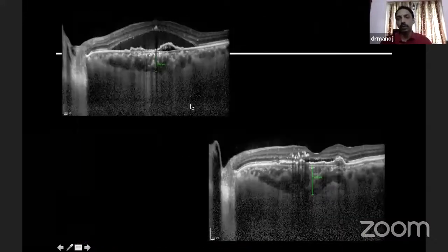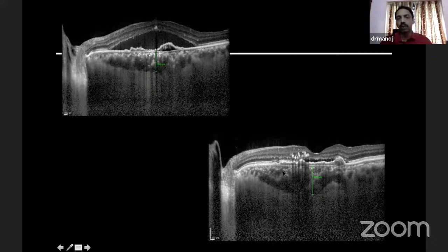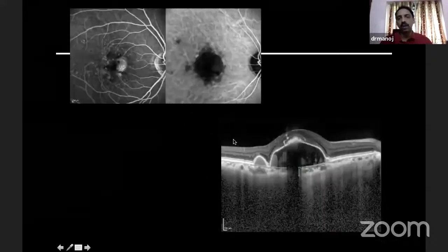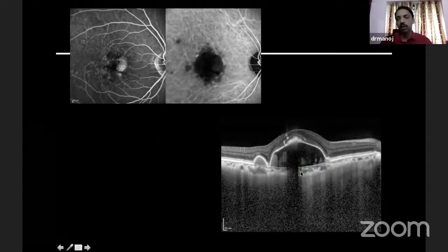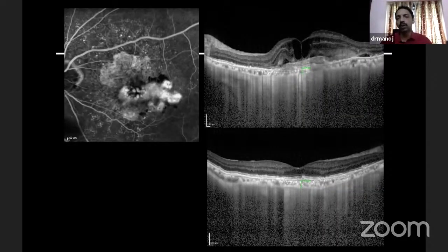This is very useful because when you see a patient with CNVM, if you look at the thickness of the choroid, it helps identify the type of CNVM. These are examples of CNVMs where you can see the retinal pigment epithelium is primarily affected, but the choroid is thicker — if you have a thicker choroid with CNVM, this is most likely polypoidal choroidal vasculopathy (PCV). Whereas this is another patient with CNVM but the choroid is not thicker — this is how a typical AMD looks. In PCV the choroid is thicker; in AMD the choroid is not so thick. And this is a myopic CNVM where the choroid is extremely thin.